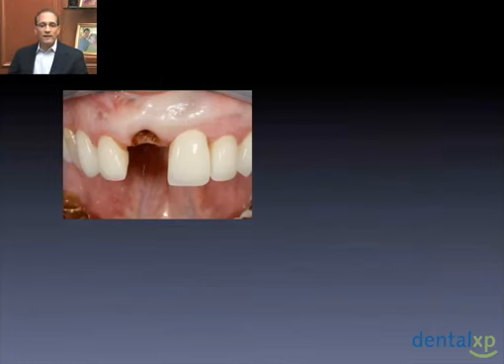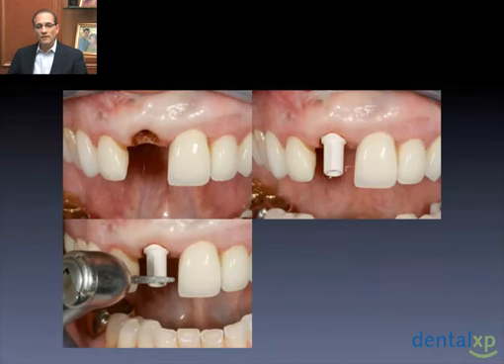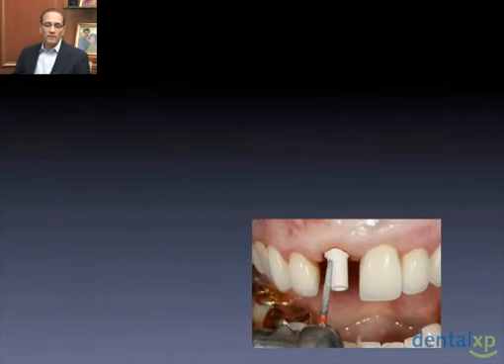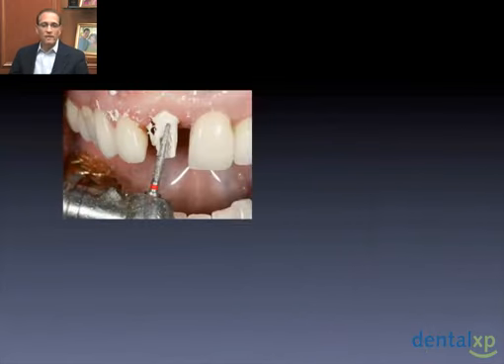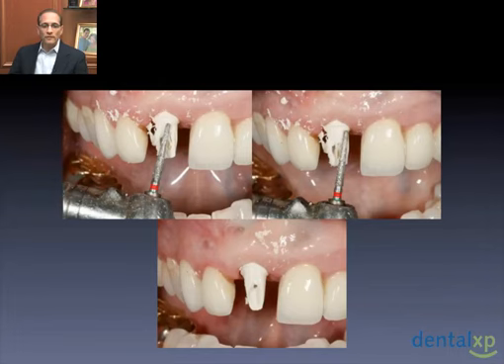So I go back to the mouth. I've decided enough lasering. I'm going to take now my provisional abutment. I'm going to put it in the mouth. I'm going to start to create and shape my provisional abutment chairside in the mouth. I'm going to start to create abutment form and get approximately what I'd want the margins and the shape to be. But again, as you can see, this provisional abutment doesn't fit the soft tissue situation exactly the way it needs to. There's a little gap and lack of contour here.